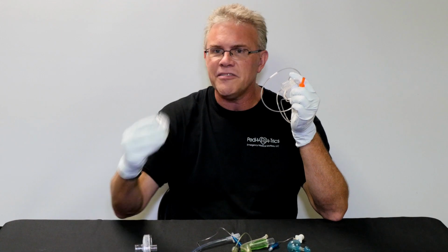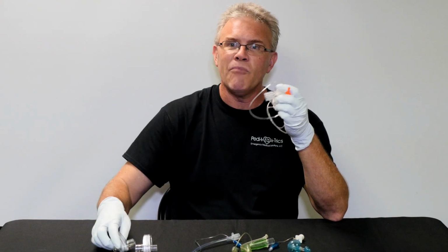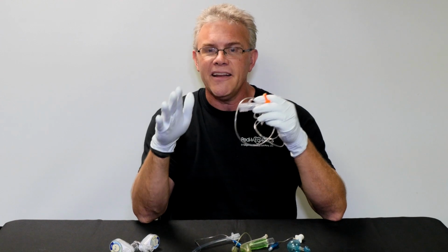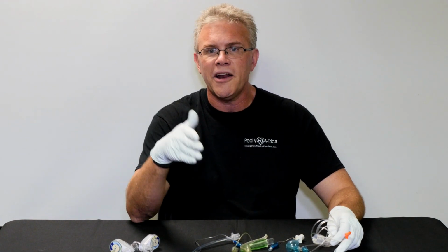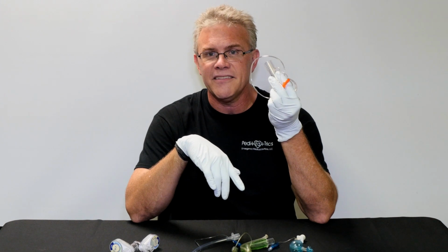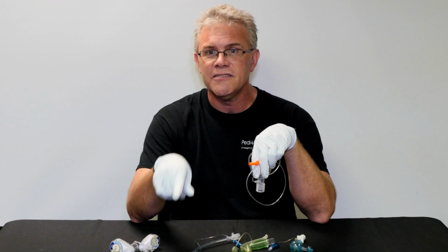So if all you have is the color change, great, feel free to use it. But more and more places happily have gone to some variation of capnometry or even better, capnography. But if you've got a king airway, an LMA, or an endo tube, or an i-gel, doesn't matter. If air is going in and out, you have to verify that it's working. And the way you do that, no trace, wrong place.